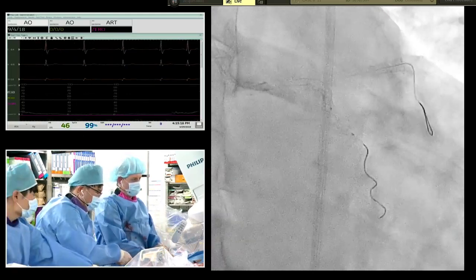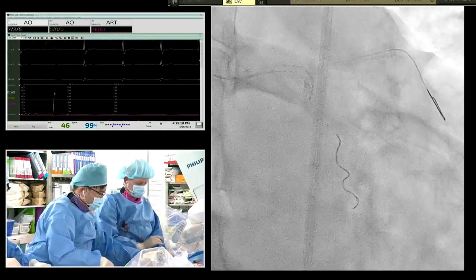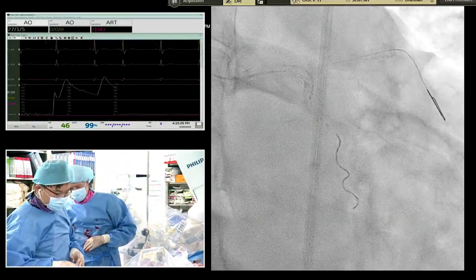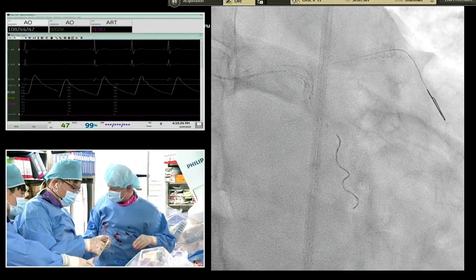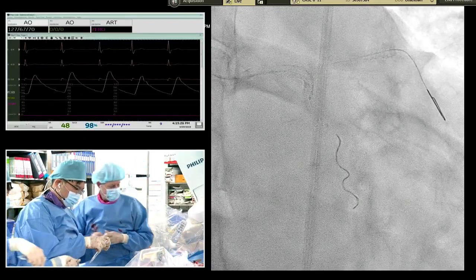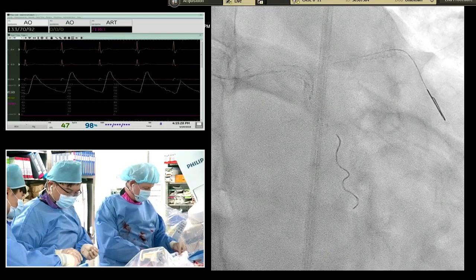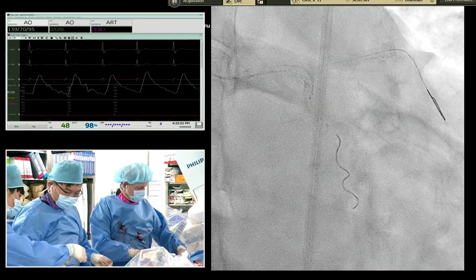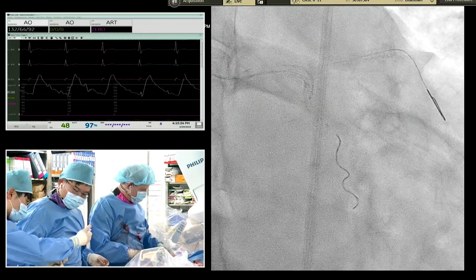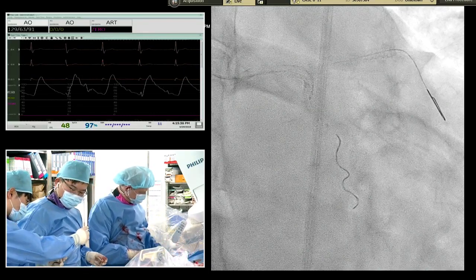These are some beat up arteries. So what's the verdict on whether to kiss it or not? We thought all along we would kiss with the drug-coated, but I don't have a lot of experience with the drug-coated balloons. Would you start with a non-kiss on the drug-coated and then kiss at the end?